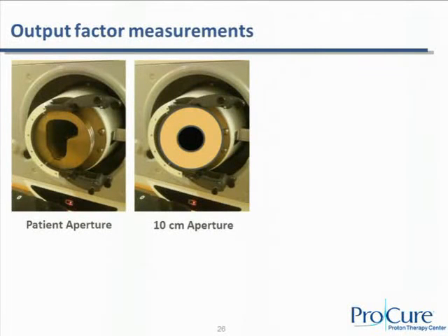What else do we do for patient devices? We measure output factors. For example, here I'm showing a weird-looking shape for an aperture, projecting the beam's eye view of that tumor from that angle.